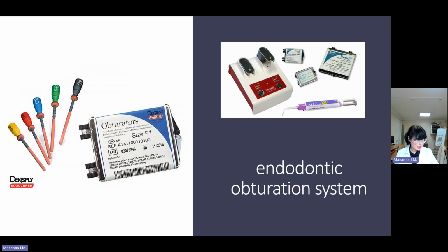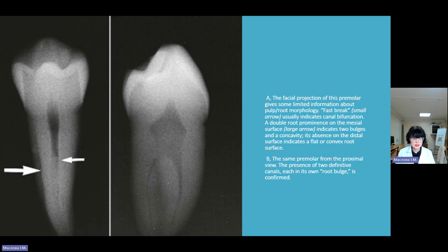X-ray investigation and complications after endodontic treatment.